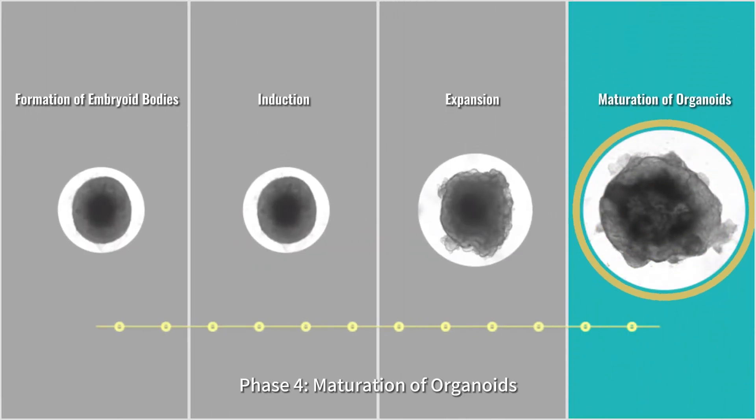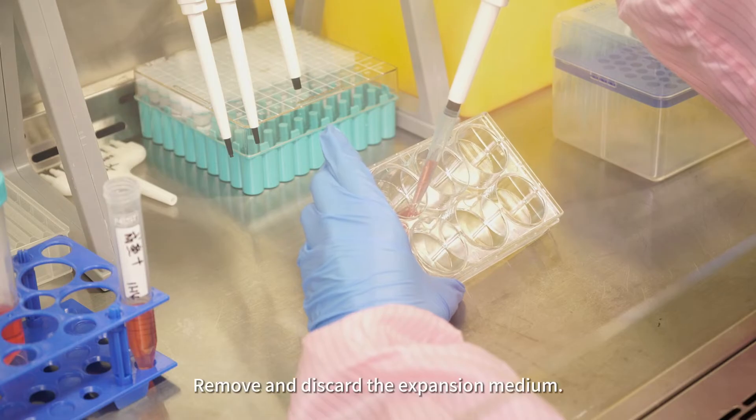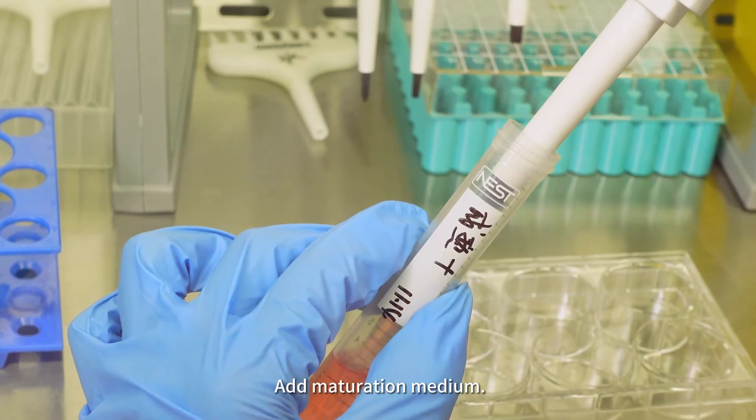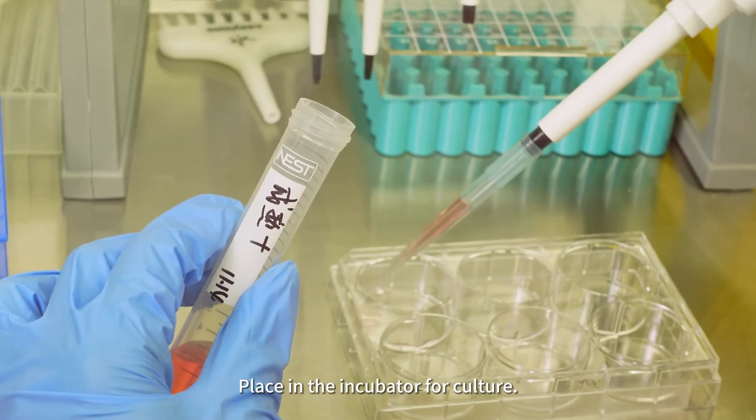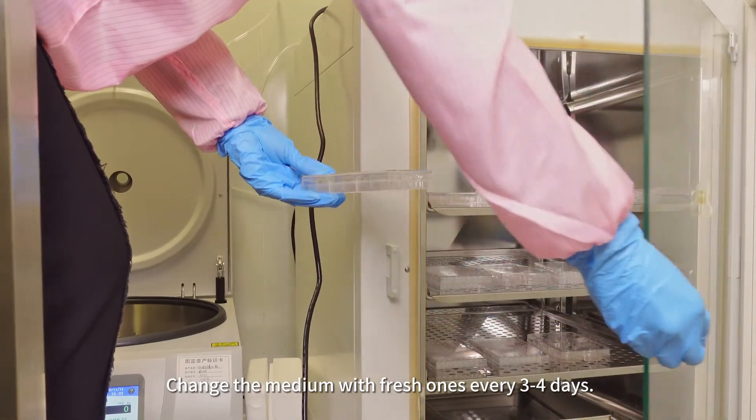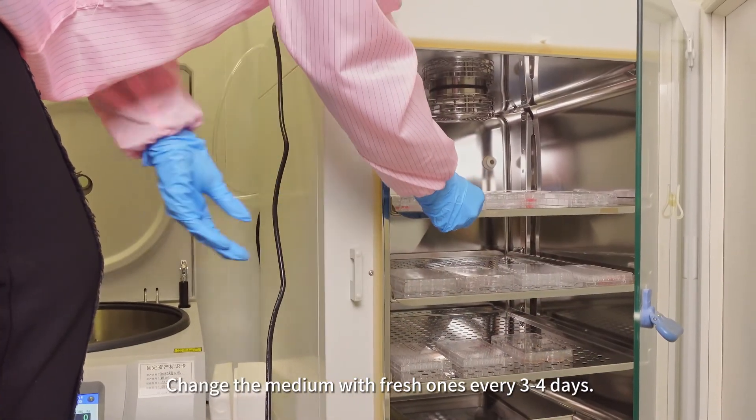Phase 4, Maturation of organoids. Remove and discard the expansion medium. Add maturation medium. Place in the incubator for culture. Change the medium with fresh ones every 3 to 4 days.